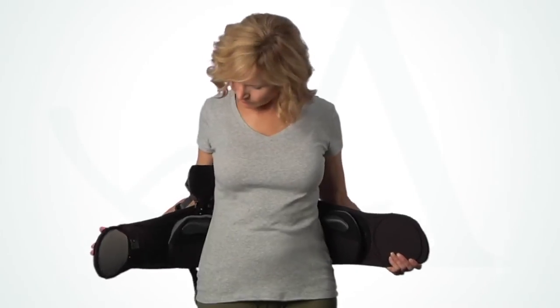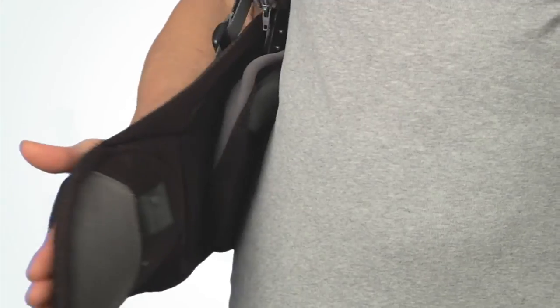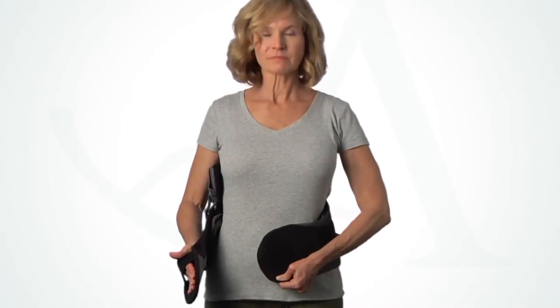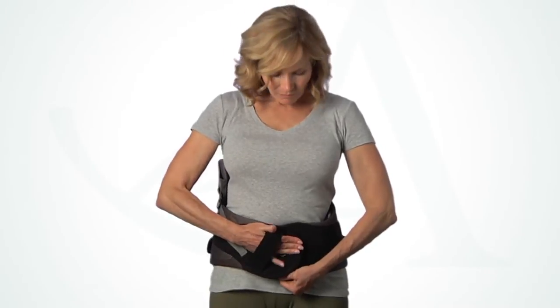It is important that you apply the brace in the same position so that it feels just like it did when you were initially fit. Inhale deeply and wrap the belt around as tightly as possible.